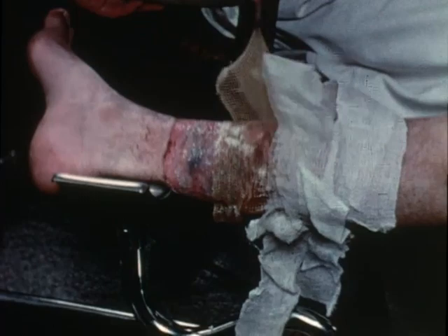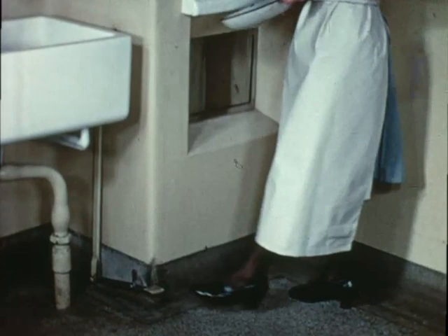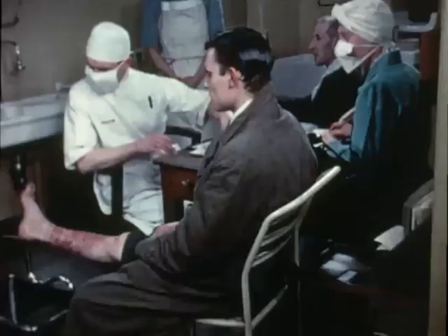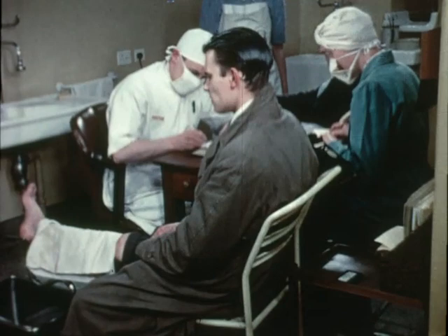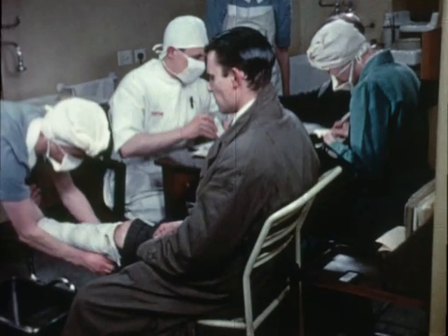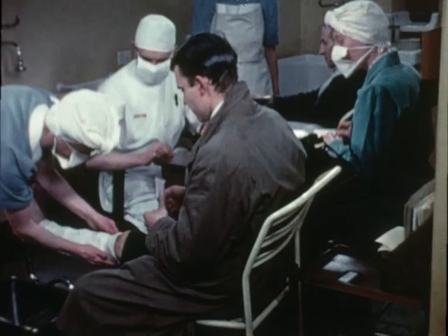All soiled material is placed in a kidney dish which is immediately emptied into a special bin. The doctor then inspects the wound. Whenever possible he uses forceps rather than fingers, because if he touches the limb with his fingers he will have to wash. While the nurse applies a temporary cover to the wound, the doctor dictates notes to his secretary and prescribes treatment. He also makes a note of the treatment on a slip of paper which he gives to the patient to take to the nurse in the dressing room.